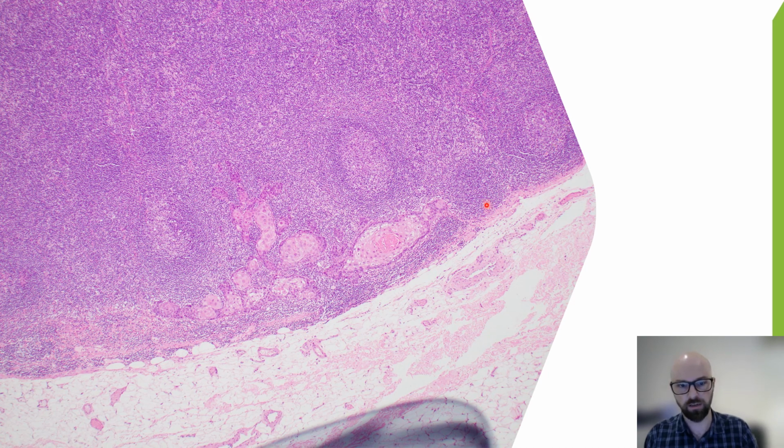then I go around on 10 times magnification, circle around the nodes and look in the subcapsular sinuses. And picking up these small mets really is just about taking your time and looking carefully. Same as the primary tumour, if the node is macroscopically obviously involved, then we take the macroscopic measurement for the tumour deposit. In a small deposit like this, microscopic measurements are required.